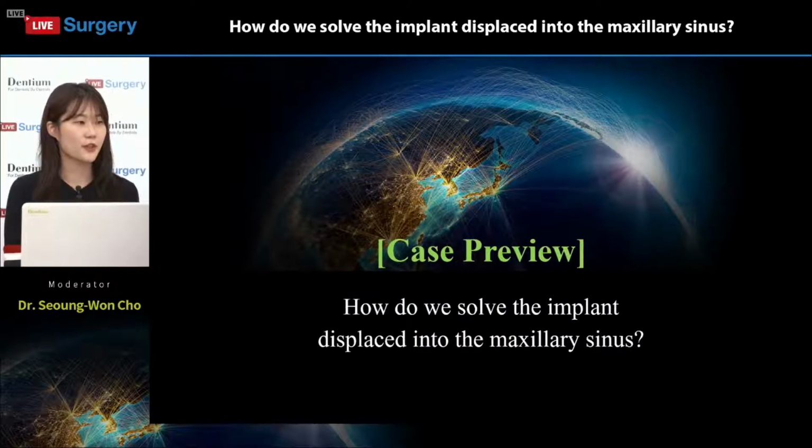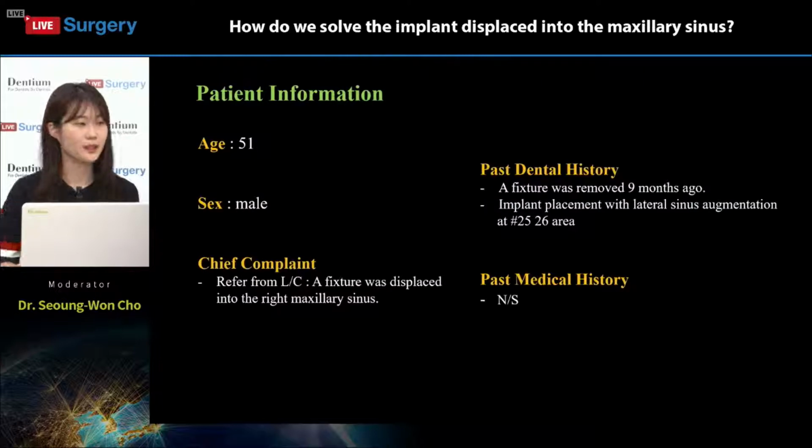Today, we will search for the answer to the following question. How do we solve the implant displaced into the maxillary sinus? Before we go right into the surgery, I will be providing a brief description of the patient information.